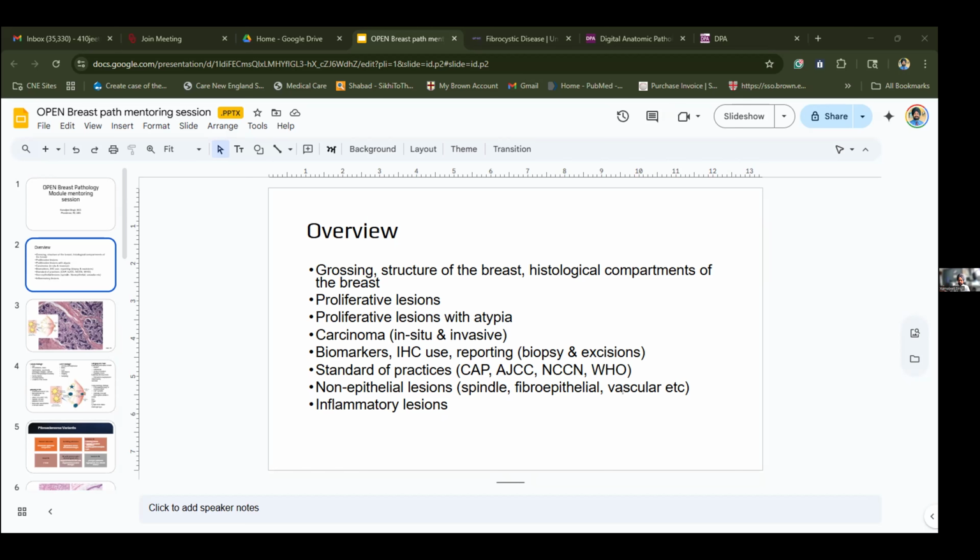So it can have both kind of proliferative lesions. And of course, the other large category is inflammatory lesion. So if you keep this table in mind, and then you go look into your histology details, eventually you will have to kind of put your histology together into these categories.